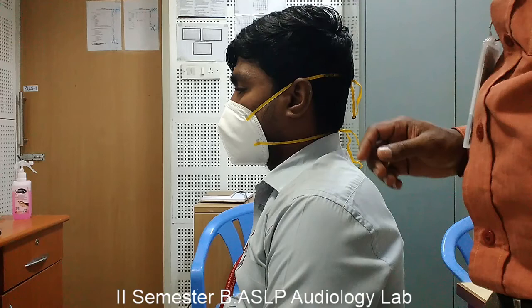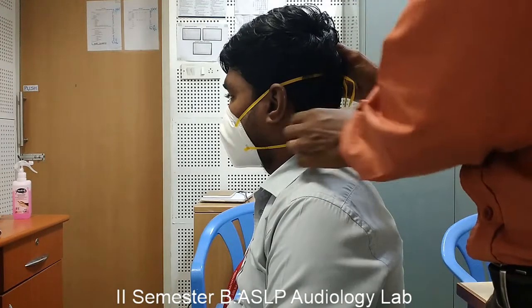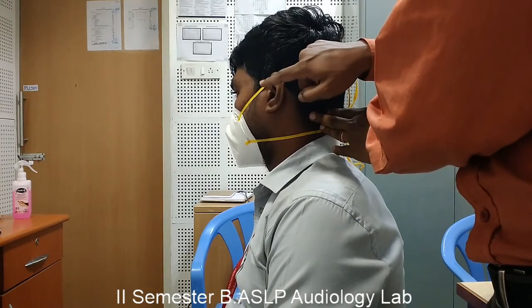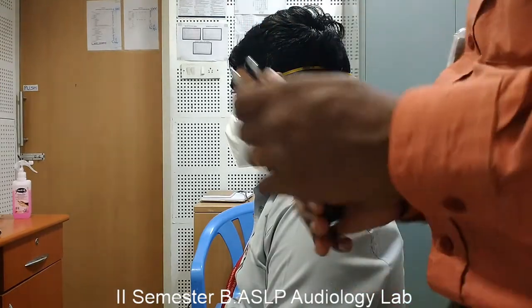Hi students, in this video I am going to demonstrate how to perform a Rinne test. A Rinne test compares the air conduction and bone conduction sensitivity of a subject. The tuning fork has to be placed on the mastoid process for bone conduction excitation — the mastoid process being the prominent bone posterior to the auricle or pinna.